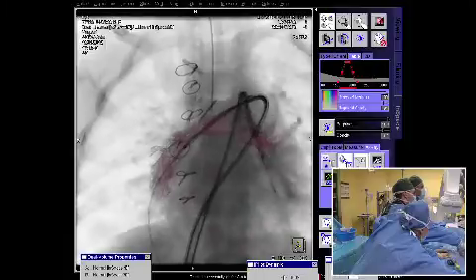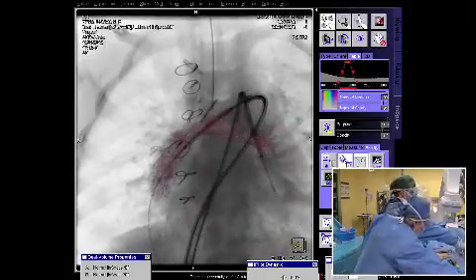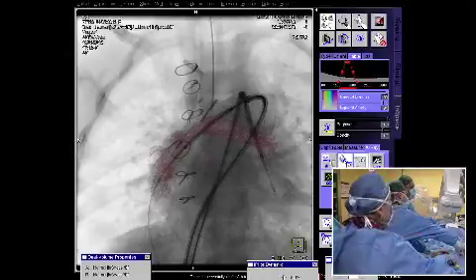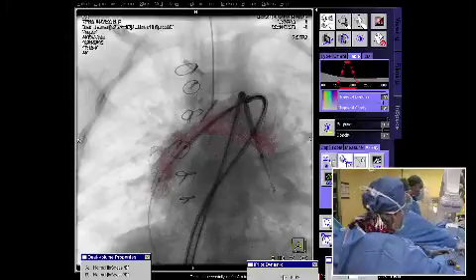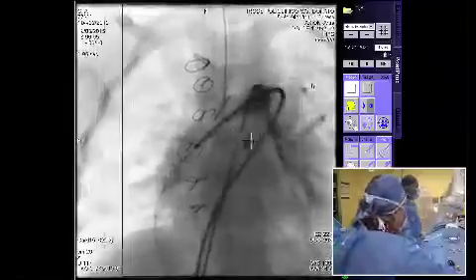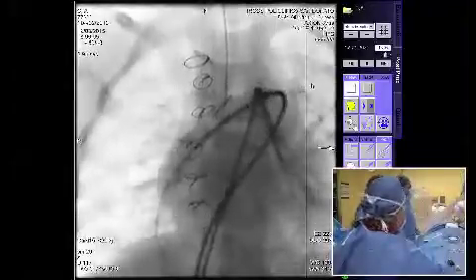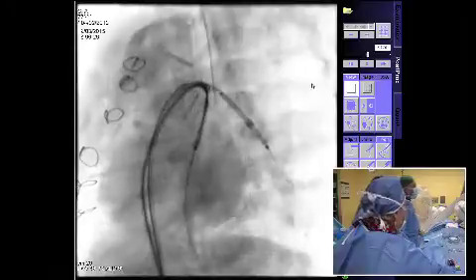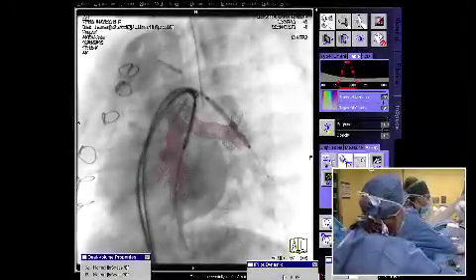And doing that, you will prevent this child in the future from being a candidate for a percutaneous valve. I think putting one stent in one branch, bringing it all the way to the MPA, then going through the strut and breaking it to the other branch and possibly putting a shorter stent there might be, in my opinion, a better option, so that you will not exclude this patient from a percutaneous valve in the future.